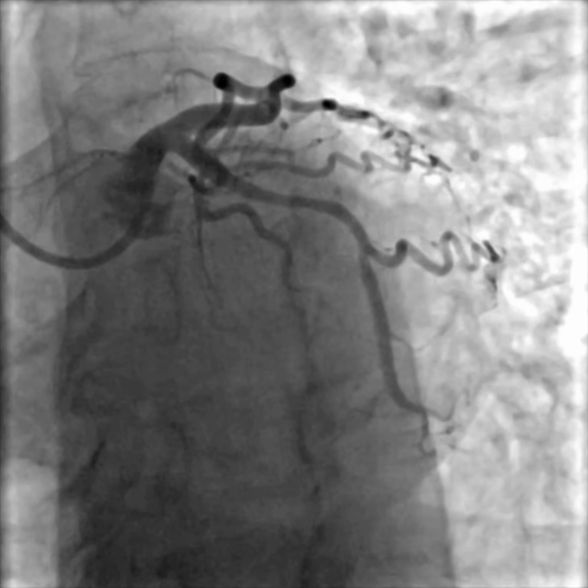And just to show you afterward, here is the size of the vessel that was completely occluded. You can see very convincingly it's a decent sized vessel, the distal circumflex, and this is actually what is supplying that territory that didn't seem to have any vessels running toward it.